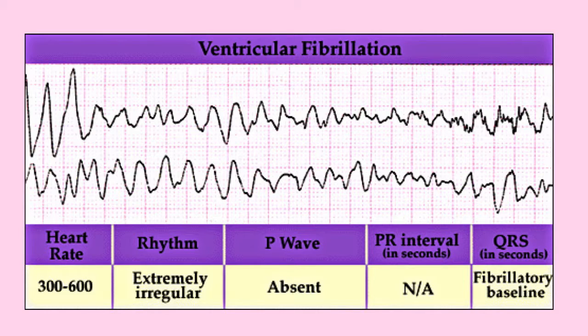If you have a patient that's doing well and talking and walking and they have artifact, you don't want to start some emergency process with them because they're okay. You just want to look at what's causing the artifact, which is that their heart is normal, but you have some type of interference problem. So keep that idea of artifact in mind, and always differentiate artifact from VFib. Okay, moving forward to asystole.